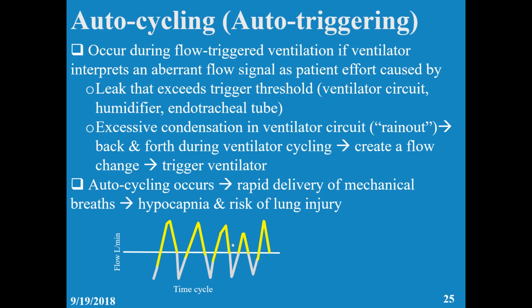So if this difference is from the circuit or from the humidifier or from the ETT and there is leak, the machine will think that this is a trigger and will start to shoot very frequently, auto-cycling, independent of the patient. So they will start like high frequency. So remember, this is called auto-triggering.